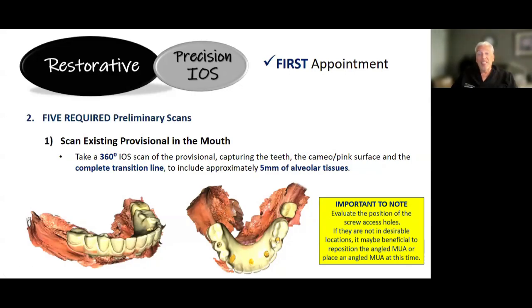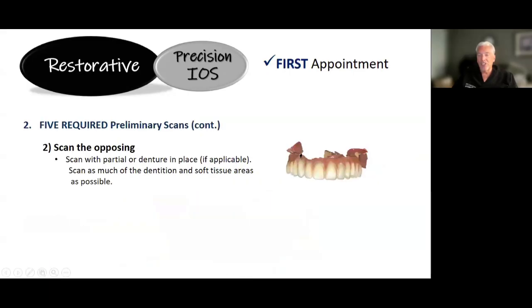So this would be the point to say, all right, we need to change out the multi-unit abutment. Maybe you had a straight abutment in the anterior, maybe place a 17-degree MUA in and bring that anterior tooth out, so that could really help with the outcome of the case. For aesthetics, for strength. Posteriorly, maybe you're getting out here on an embrasure.